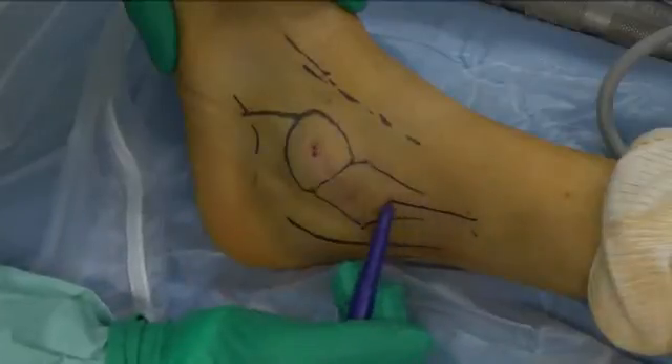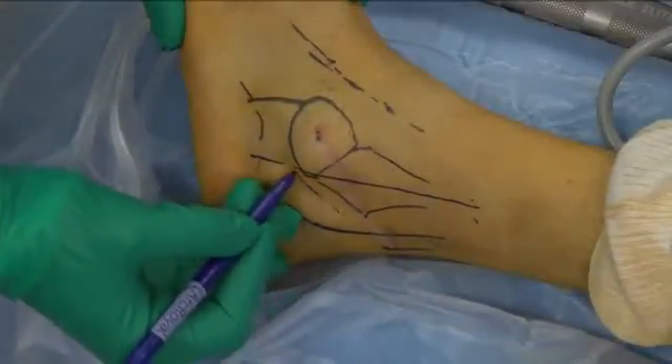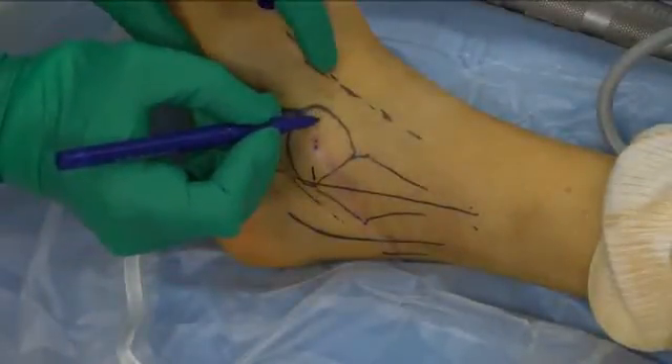The longitudinal axis of the fibula is then drawn and corresponds to the posterior limit for the middle portal, so as to protect the peroneal tendons. The two portals are drawn, starting with the middle one, on a horizontal line which corresponds to the equator of the sinus tarsi.